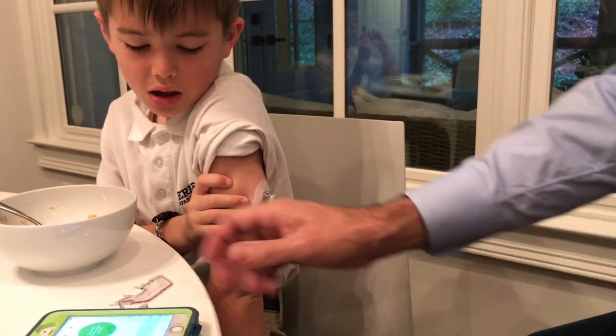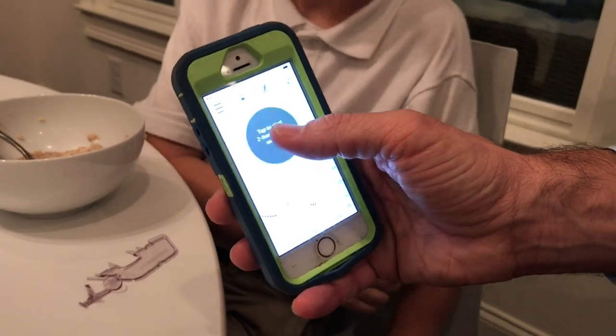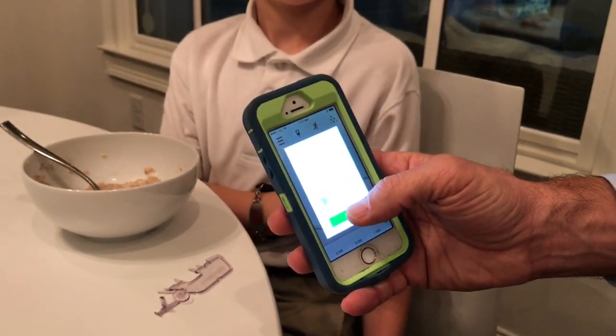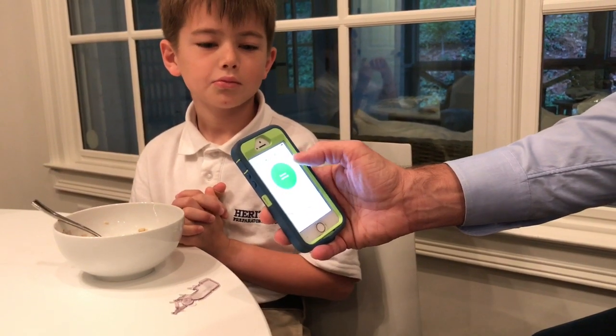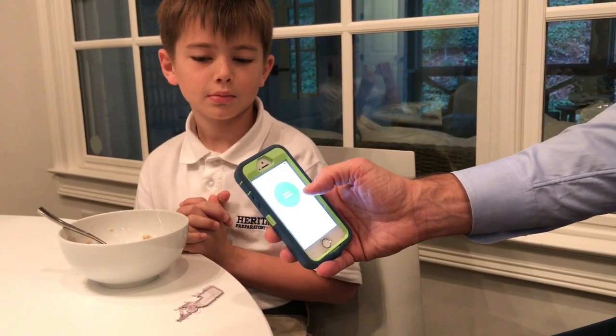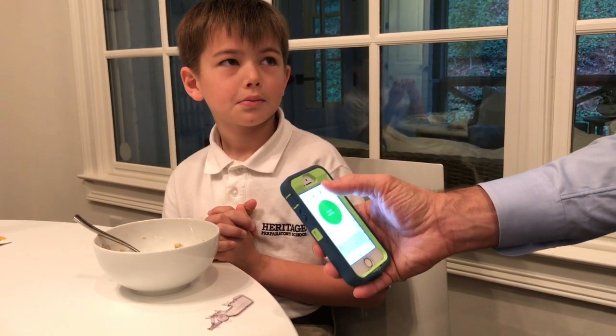Now on your phone or your transmitter you're going to start the two-hour warm-up period. During this time you won't get any readings until it's done warming up. Then you'll enter two blood sugar numbers into the phone and it'll have an accurate number.